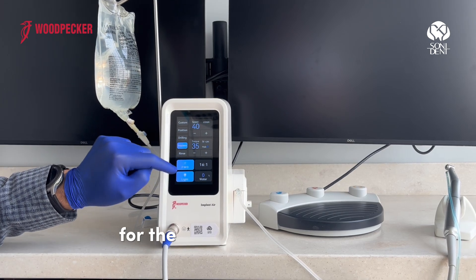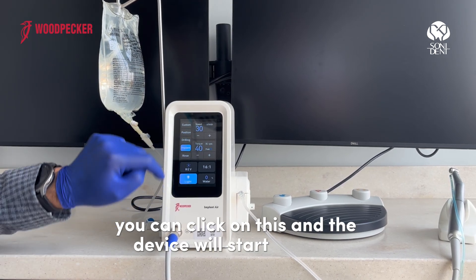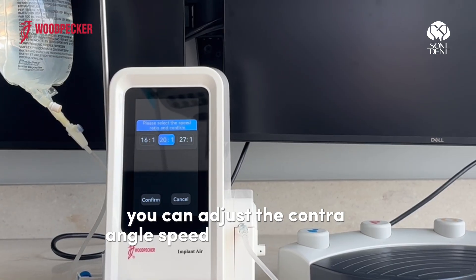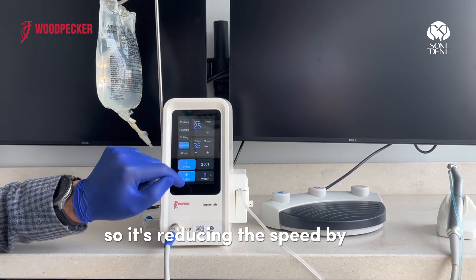For the forward and reverse, you can click on this button and the device starts. You can adjust the contra angle speed by clicking on this and confirm — it reduces the speed by 20.